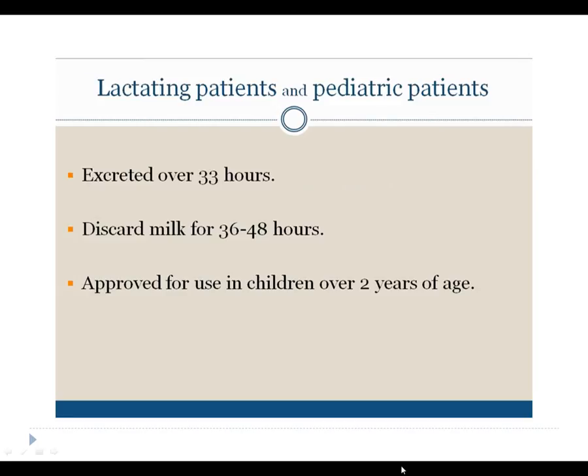MRI contrast agents have been approved for use in children over 2 years of age. The safety of MR contrast agents has not yet been determined in children under the age of 2. No biological effects have been reported thus far in this age group.